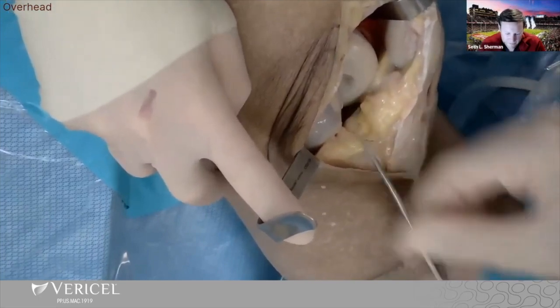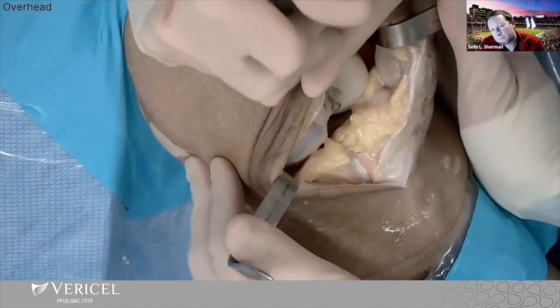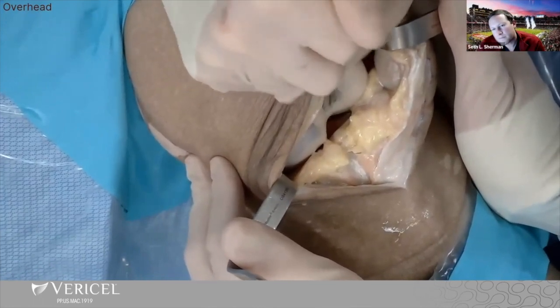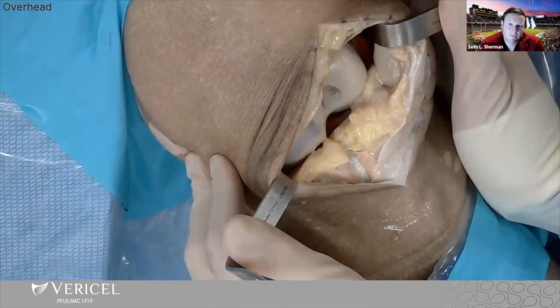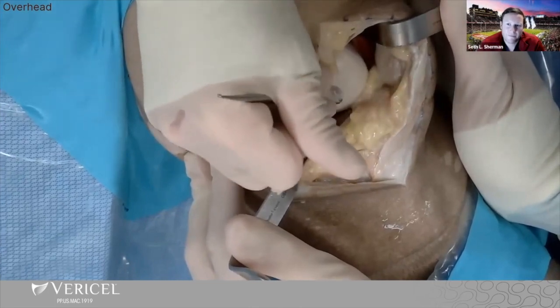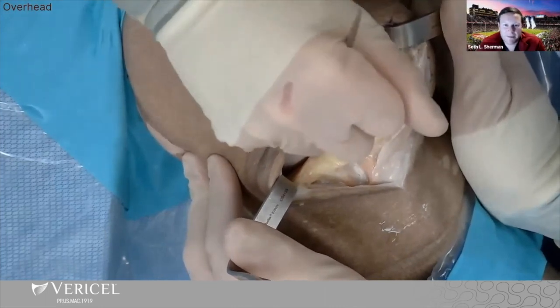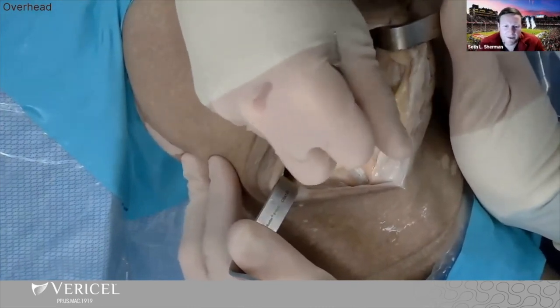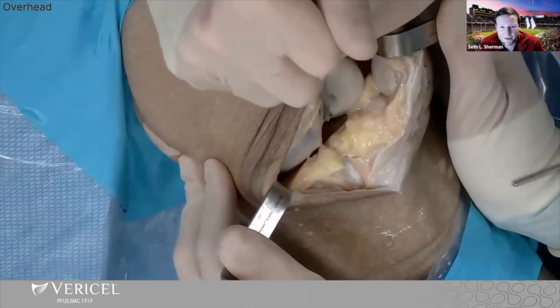Do you use a tourniquet? I will use a tourniquet. I do TXA about four minutes before I put the tourniquet up — tranexamic acid every single time — then I put the tourniquet up. I do the whole approach, then I take the tourniquet down and take care of any bleeders. I find that much more efficient. Early on I did it without tourniquet the whole time, but I'm much more efficient with the tourniquet up first, and then the TXA usually kicks in really well. If you don't damage the fat pad too much, you really don't have that much to do. For my combined big osteotomy cases, I'm not using tourniquet as much, but for a lot of intra-articular work — revision ACL, meniscus transplant, plus a cartilage defect — I will use a tourniquet for a lot of the time.